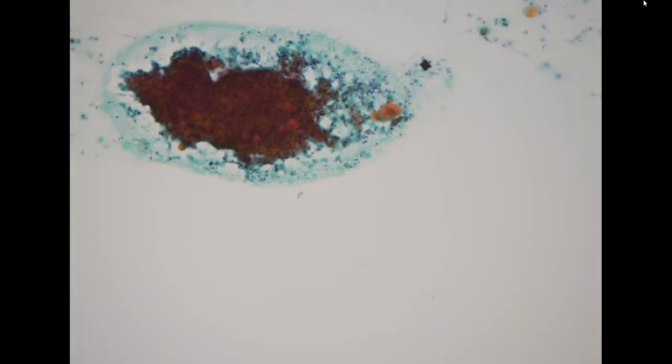So the next case is a 71-year-old male. This is from a lung biopsy. This is from the touch imprint of the lung needle biopsy. So usually in this specimen, we don't have a lot of cells, and it can easily dry out, showing this drying artifact.